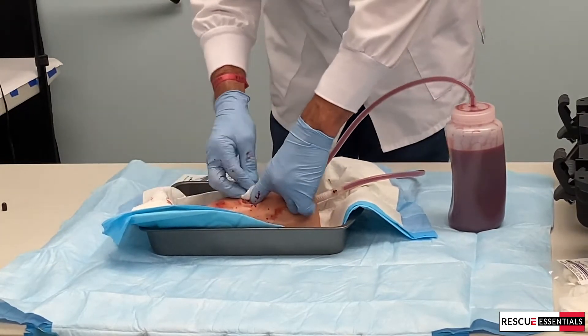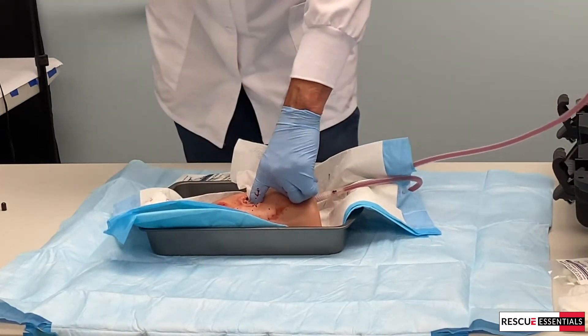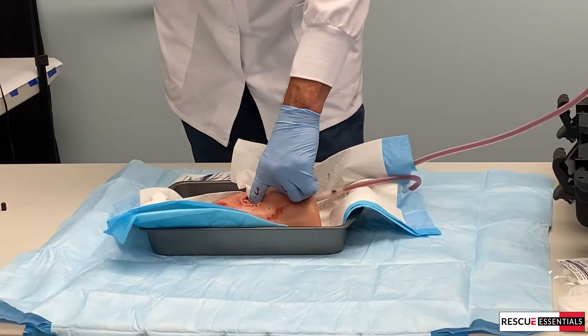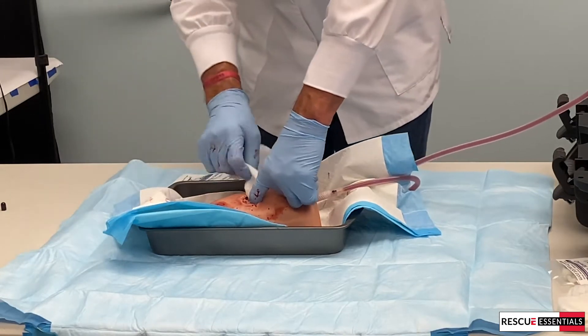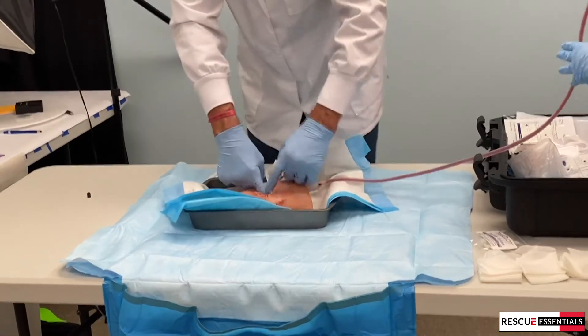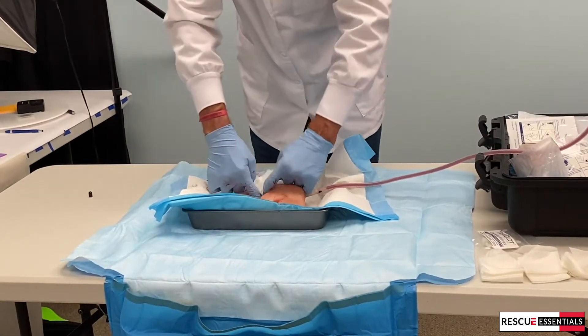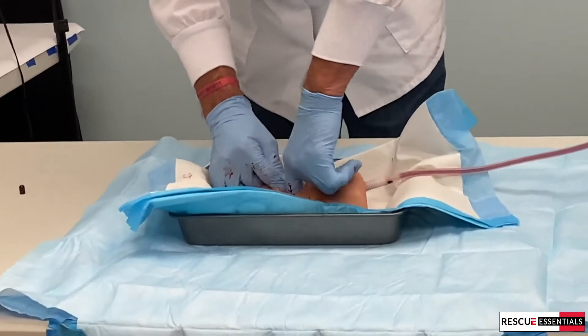One thing I didn't tell you is when you first start packing, you can just take this z-pack and drop it down your shirt and it's going to unfold and be out of the way. So I'm going around the world, making sure I'm getting all the voids in this cavity.